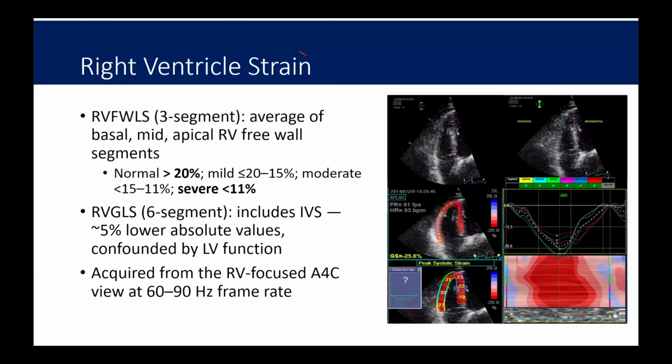Something new in the guidelines is right ventricular strain. Unlike TAPSE and S prime, your right ventricular strain is a more sensitive and early marker of right ventricular dysfunction.